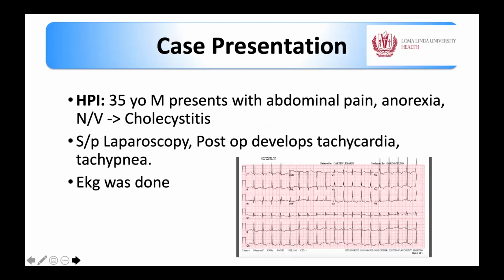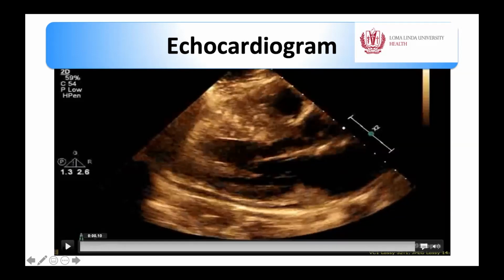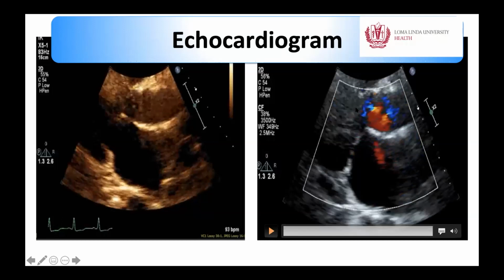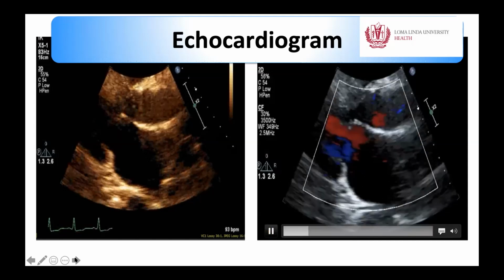So let's take a case. A 35-year-old male presented with cholecystitis, and post-operatively after laparoscopy developed tachypnea, and an EKG is done. And this is his echo. You can see that there is quite a bit of asymmetrical septal hypertrophy. I'm trying to see if there is any SAM or any mitral regurgitation, and you don't see much mitral regurgitation. Maybe there is some crowding here, so you can't figure out if there is SAM or not.